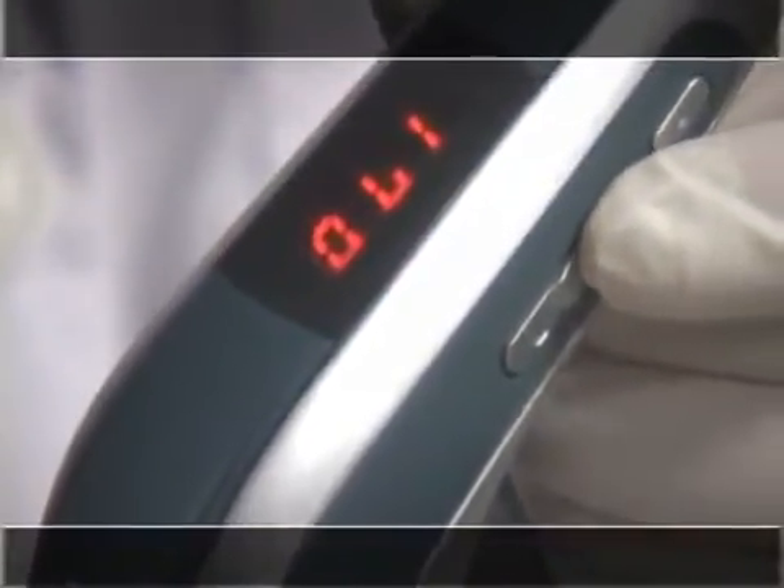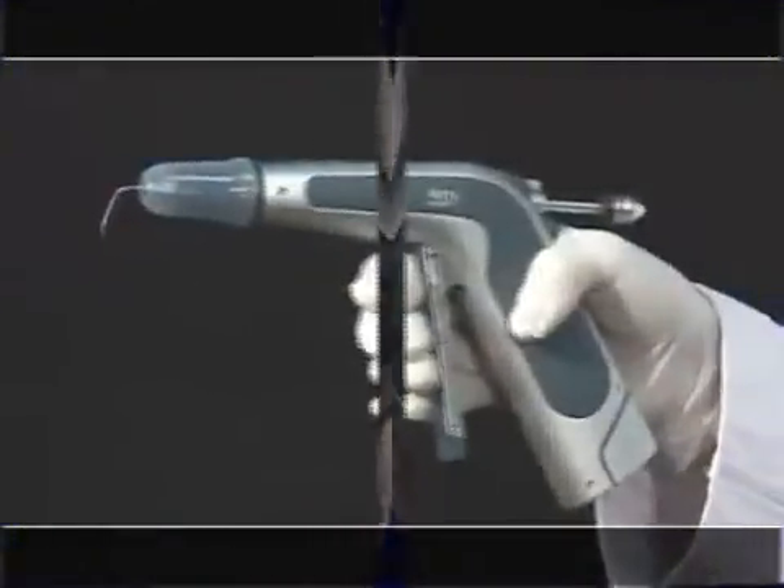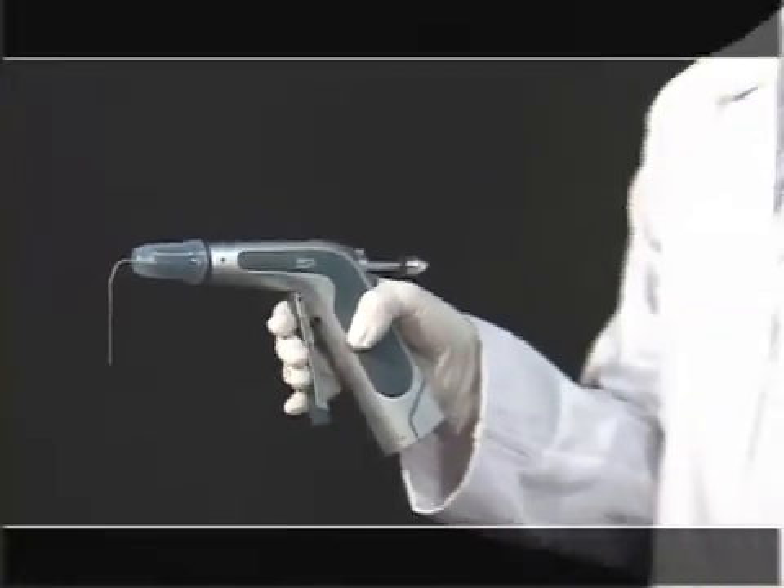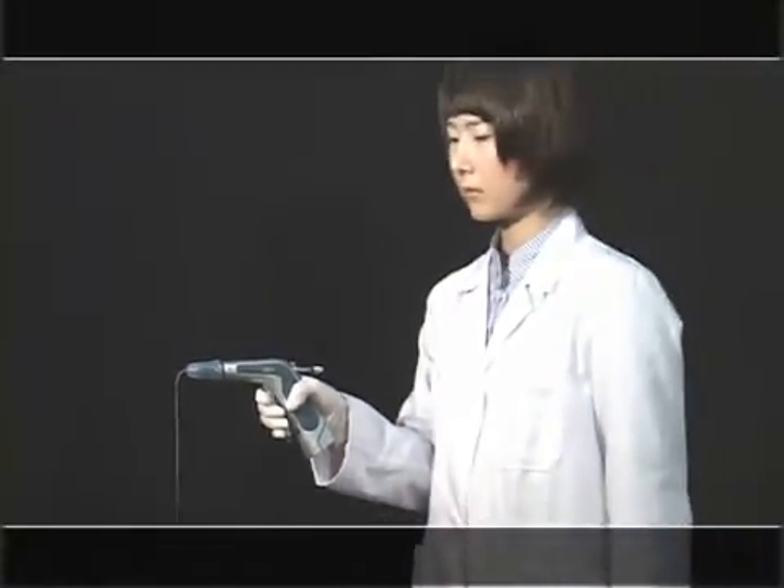Press the power button until the temperature is shown. Adjust the temperature with the temperature control button. It takes about three minutes to reach the adjusted temperature. When pulling the trigger slowly after three minutes, the warm Gutta-Percha flows out.